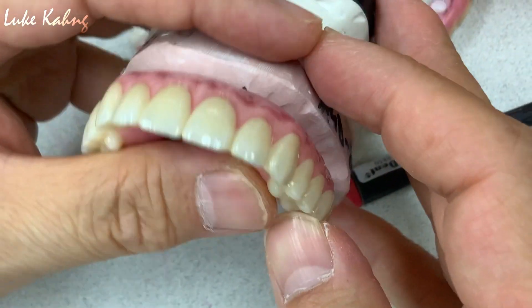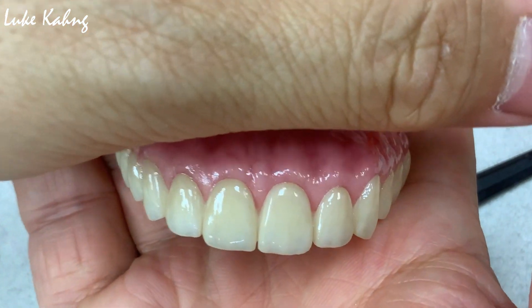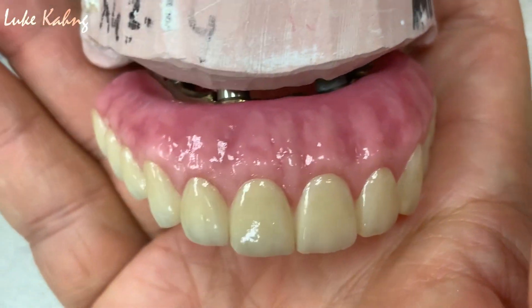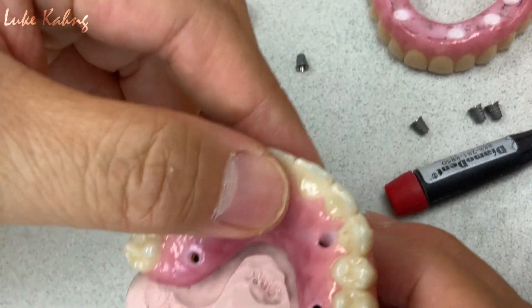After that, we are going to do a soft night guard for this. And this is no compromise — it is another alternative full mouth implant prosthetic solution, like I wanted to share with you.